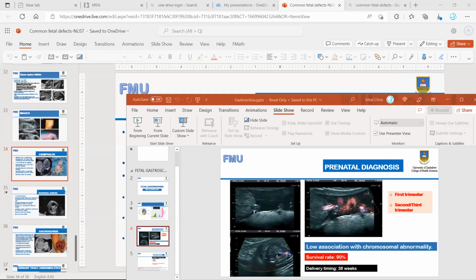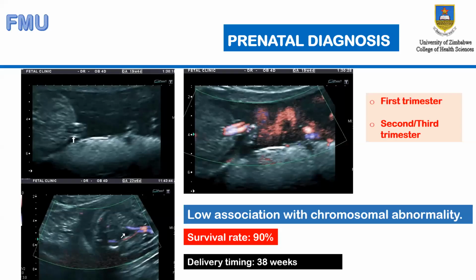To just go through it again, we're saying when you are doing abdominal circumference and you go down, you are going to see these 3 lines. You should always see them. If you don't see the 3 lines, there is a problem. Don't normalize things. If you don't see the 3 lines, recognize that the abdominal wall may be having a problem and you refer.